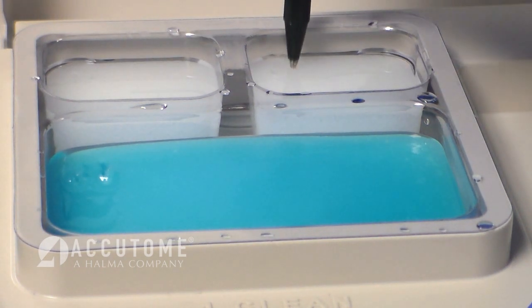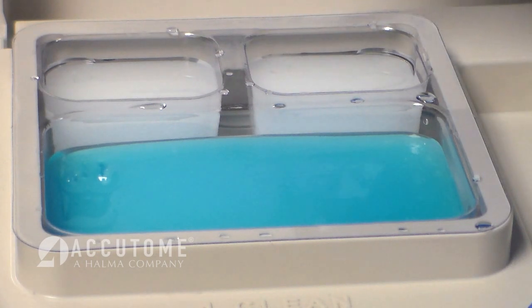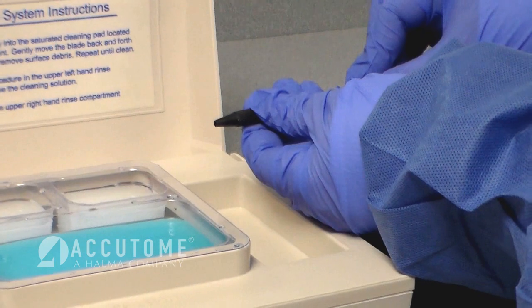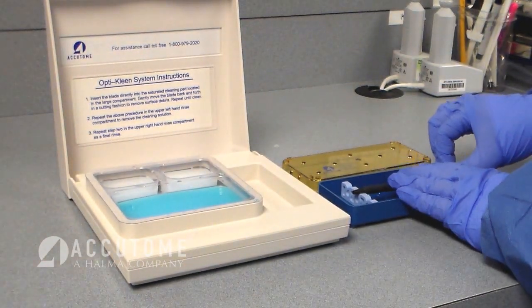This process allows blades to be safely cleaned without dulling, chipping, or breaking the diamond. Retract the diamond blade knife back into its handle and place it back into the instrument tray. It is now ready for processing and sterilization.